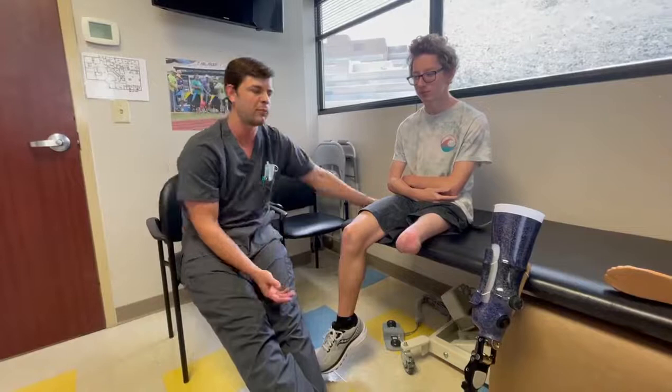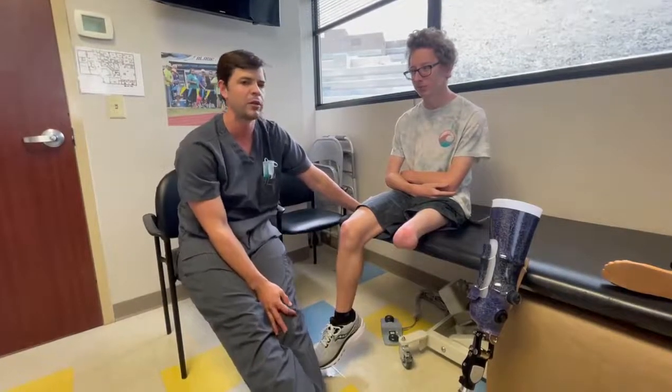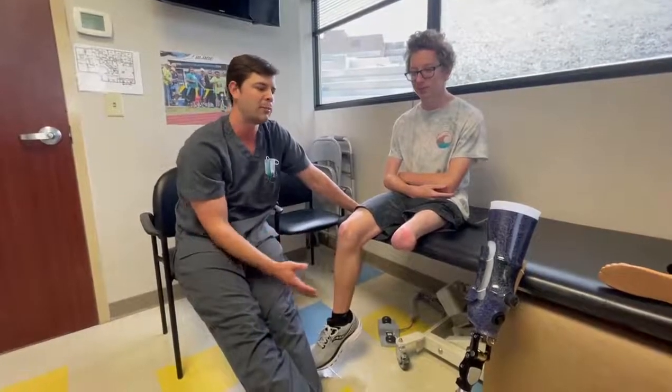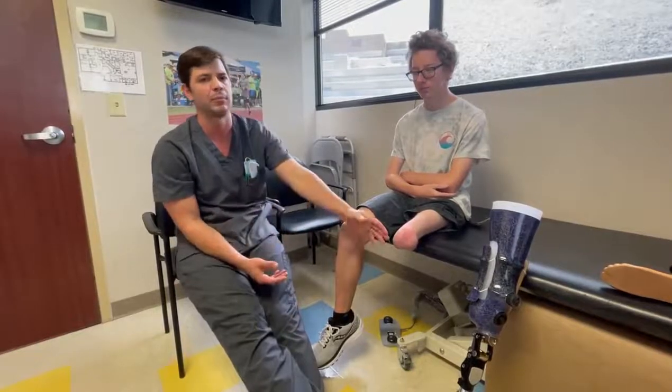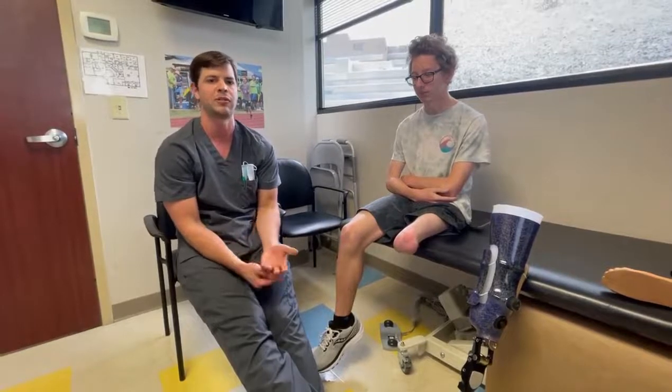When we first saw him, he was unable to bear weight distally on his femoral condyle. The femoral condyle has cancellous bone, and when you don't load that bone over time it becomes very sensitive to weight-bearing. We want to promote distal end bearing, which promotes stronger, denser bony tissue that you can actually bear weight on distally.